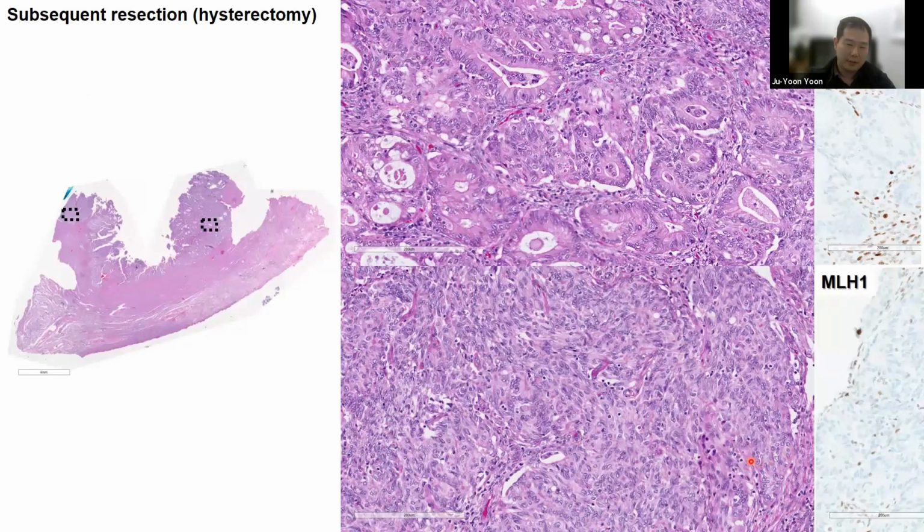Okay, so this patient underwent subsequent resection, hysterectomy, and you can see some of the regions here. In case you can see that, I'm just going to close it. In an area which is clearly endometrioid, but interestingly had an area where it has a little bit more spindle morphology to it, the further staining workup showed that this is also actually still carcinoma, but just has an unusual morphology.